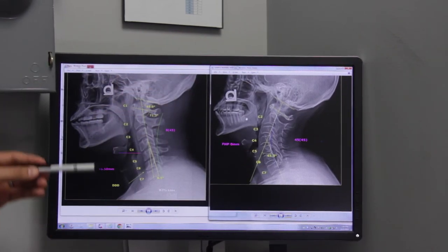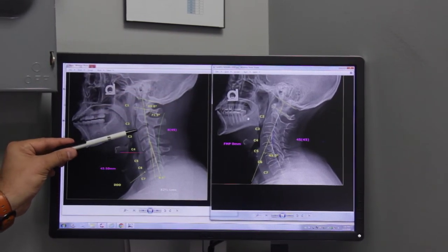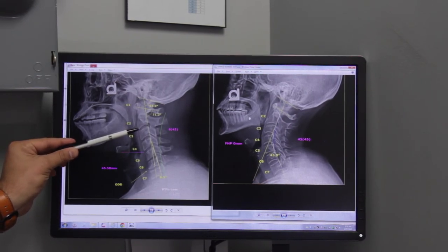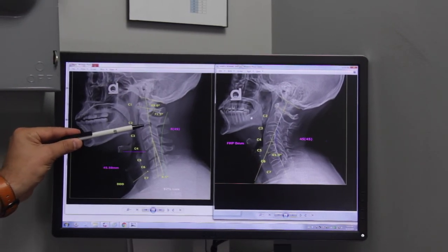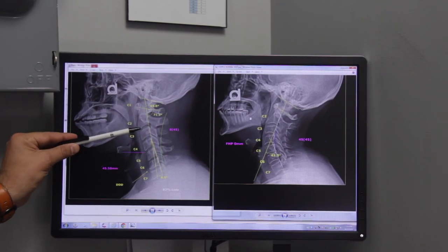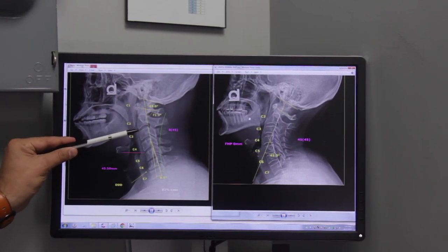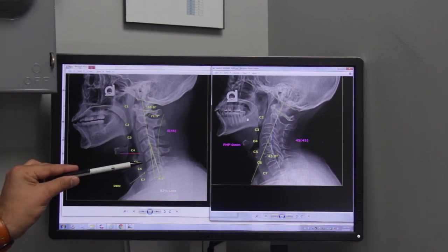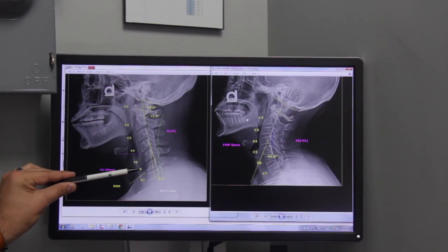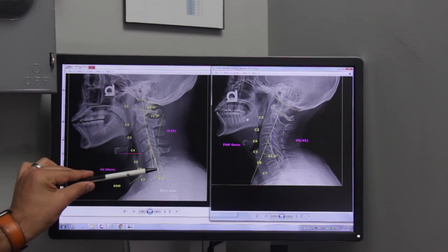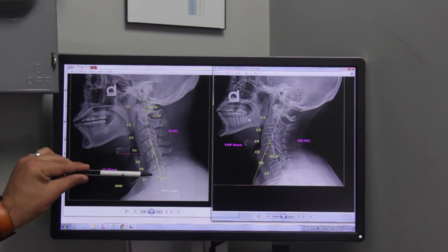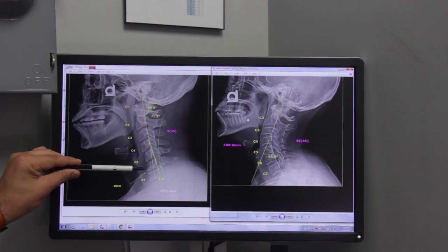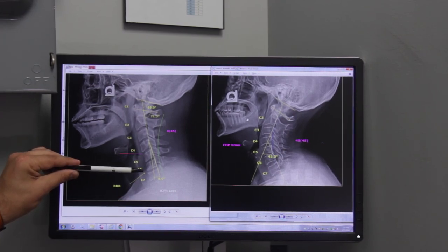The last thing we're going to look at is the spacing in between the joints, which most people are familiar with as disc tissue. The actual bone is the white, and the black space is the disc. They should be nice and equal, like you see here. But in this gentleman, you'll notice that it starts to thin out right there and right there. We do notice some degeneration or bony change — these would be bone spurs starting to develop in this individual.